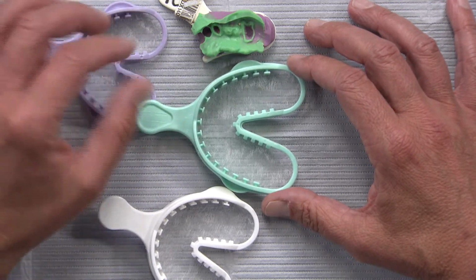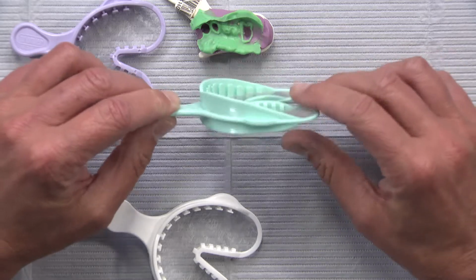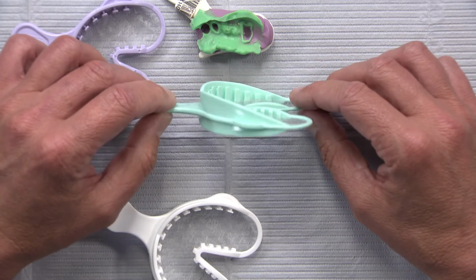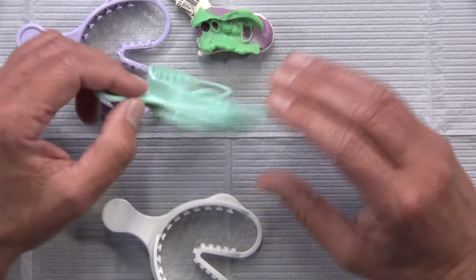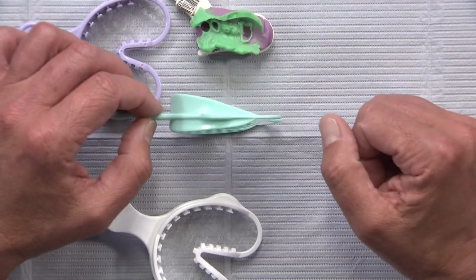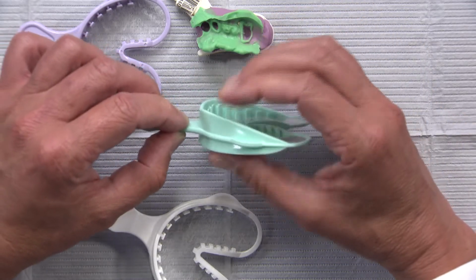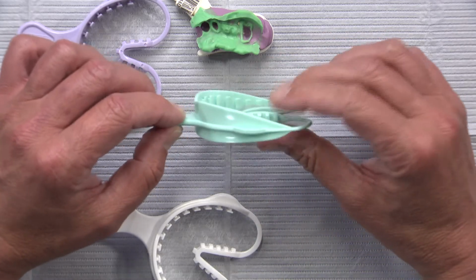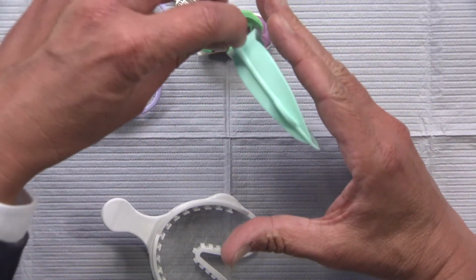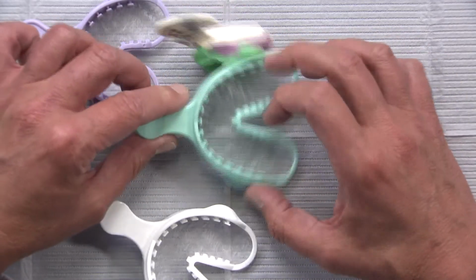if we're, like we just made a sports guard for my son who plays ice hockey, we fill both sides of this with an alginate replacement material, goes in his mouth, bites together and holds it, and it takes care of 2 impressions at the same time. And unlike in some upper alginates where your mouth is wide open and you're kind of drooling, there's something nice. I think it's easier actually than taking an upper and lower alginate separately to bite into something and have your teeth close inside the impression. It's much more comfortable feeling for a patient than it is being wide open with this upper alginate in. So my son tends to gag a little bit and does better when we do the upper and lower at the same time.